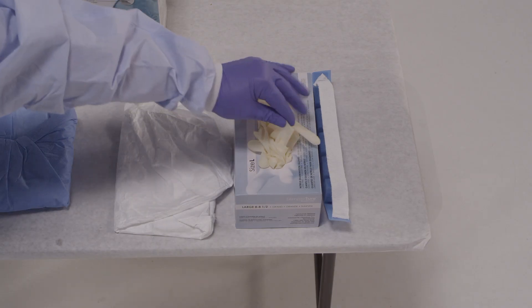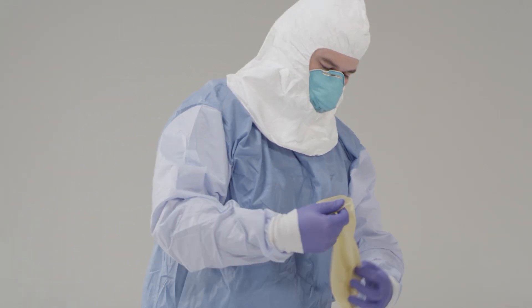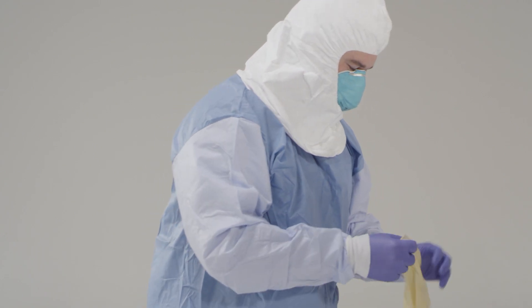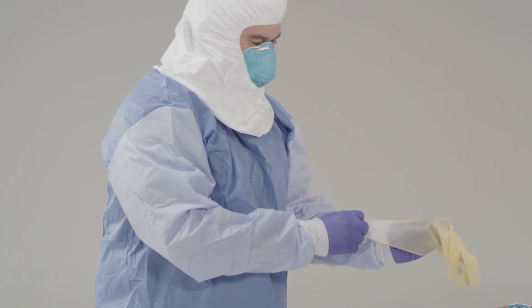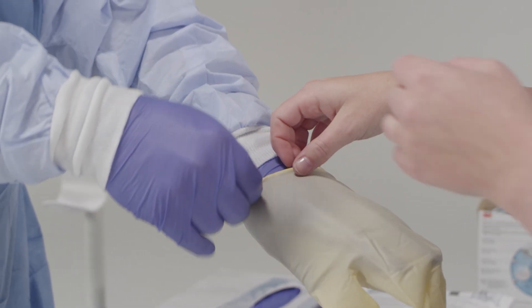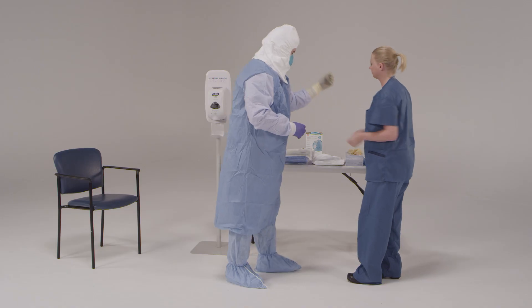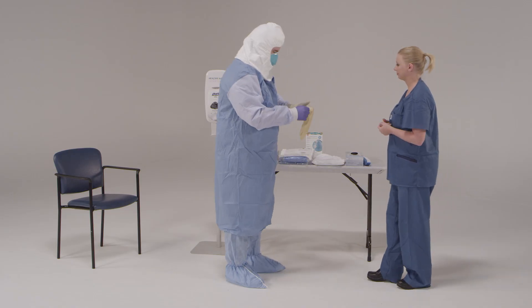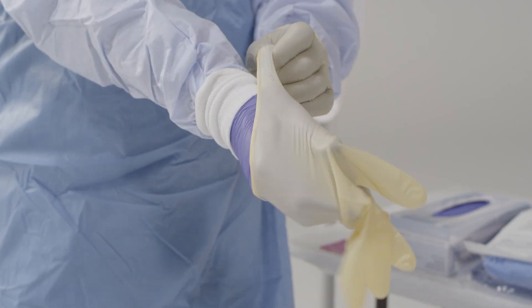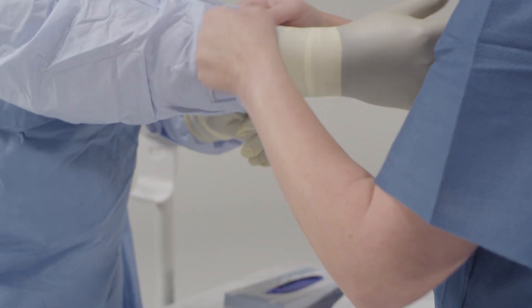Now put on your outer gloves. If you need help, just let me know. Double gloving provides an extra layer of safety during direct patient care and during the PPE removal process. When putting on these gloves, make sure that the cuffs extend as far up your arm as possible and are over the cuff of your gown. Some facilities have found that using different colored gloves for the outer gloves is beneficial, as it helps to rapidly identify any breaches in glove integrity.